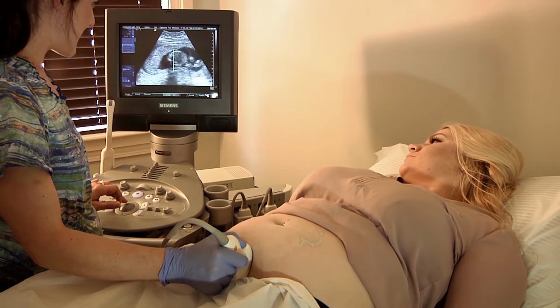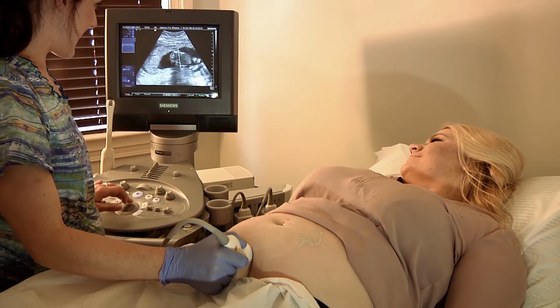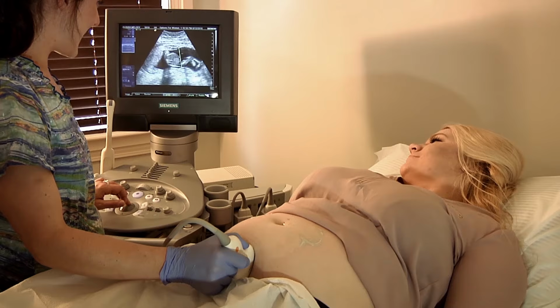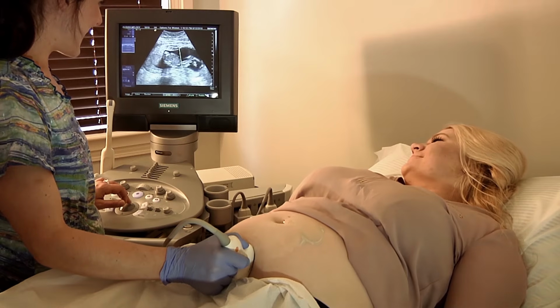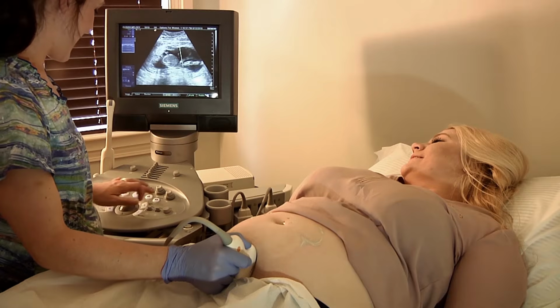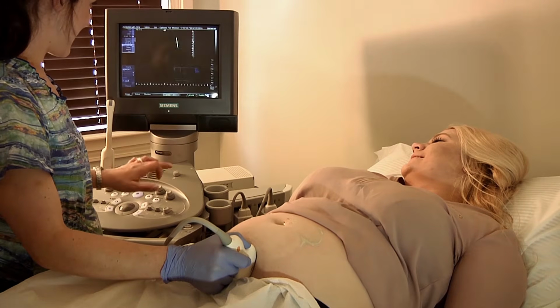Now he's moving on you. Go give mom a kick again. So forget the heart. He's moving. So take it out of M mode. Just hit M mode again. We'll go.